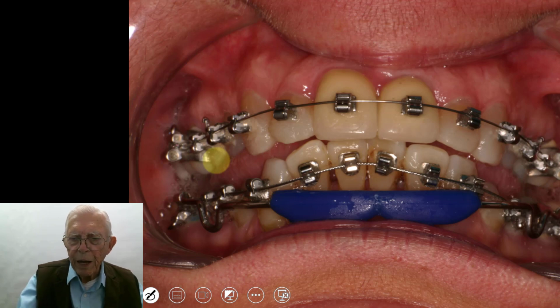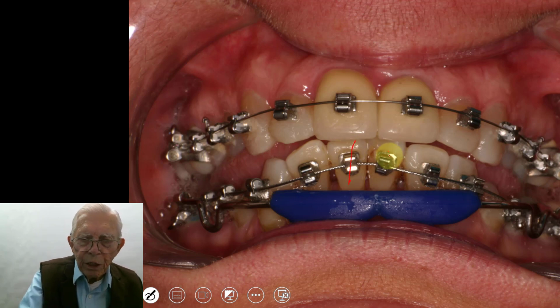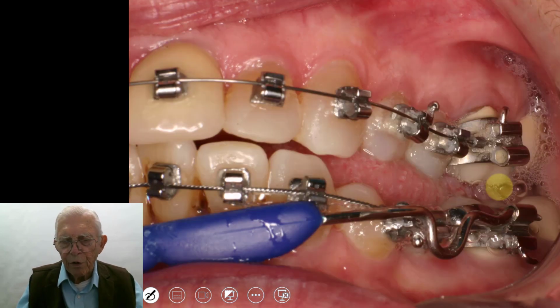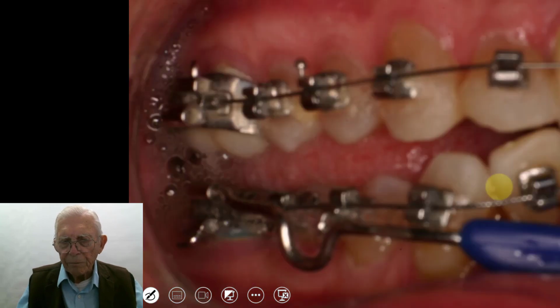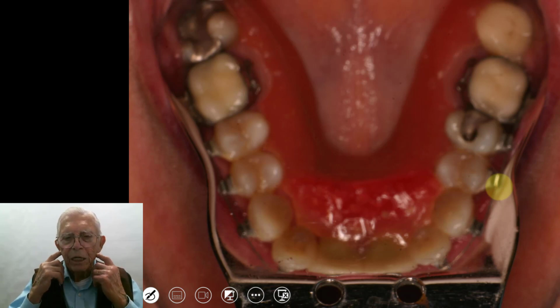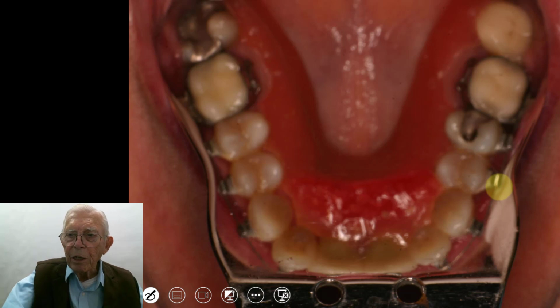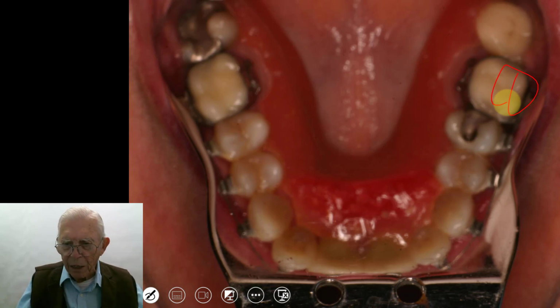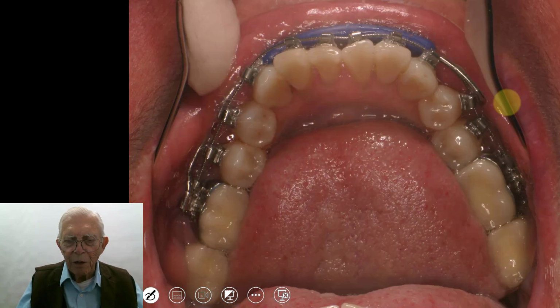Now we've expanded and got the teeth in, but we still need to put an intruding arch out here to bring this down, and your lip bumper is running interference for this. Now the force that we push back with the lip goes back to the 6-year molars, where the lip bumper's attached. It pulls that back, and you can use that to bring the upper anterior teeth back in. Just turn it in reverse on there.